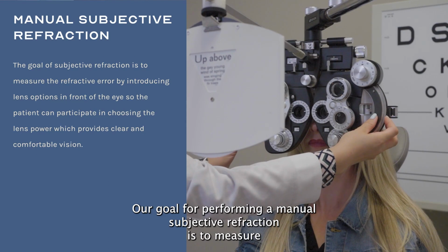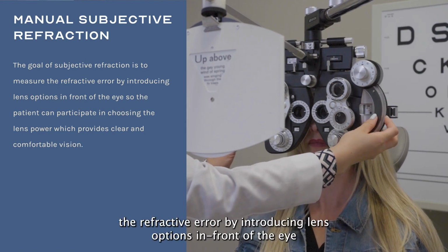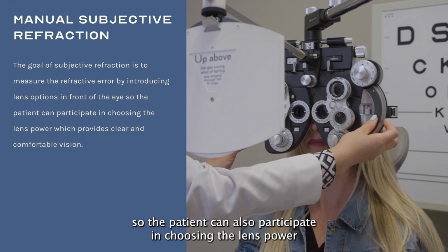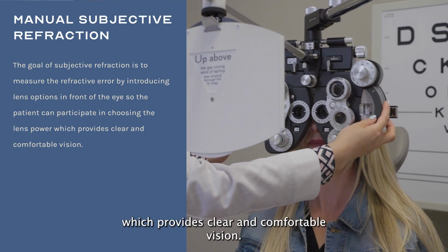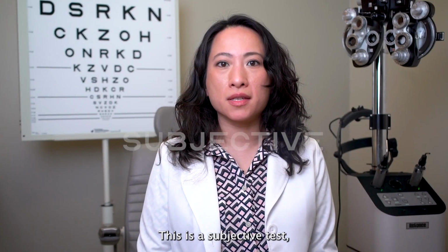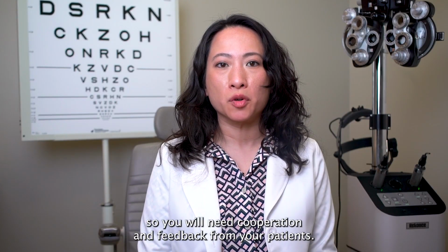Our goal for performing a manual subjective refraction is to measure the refractive error by introducing lens options in front of the eye so the patient can also participate in choosing the lens power, which provides clear and comfortable vision. This is a subjective test, so you will need cooperation and feedback from your patient.